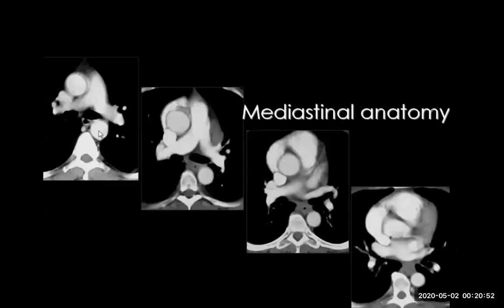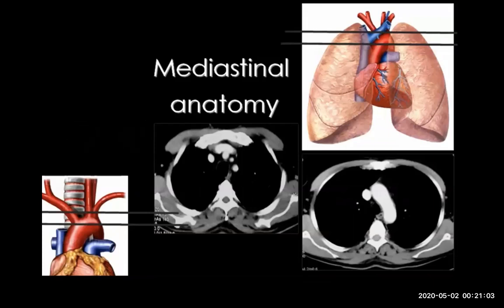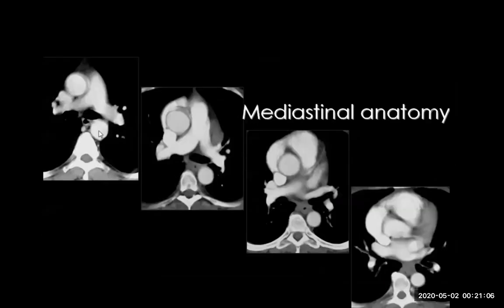For example, here is the main pulmonary trunk, right pulmonary artery, and left pulmonary artery — very important and crucial for assessment of pulmonary embolism, and for traumatic patients to assess the ascending aorta and cases of aortic dissection. Going down, you get this section, until you reach the heart and the cardiac chambers.